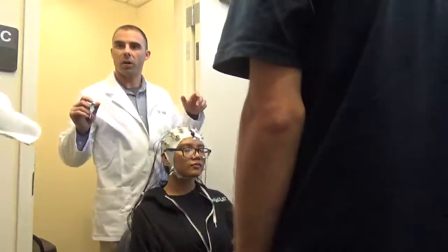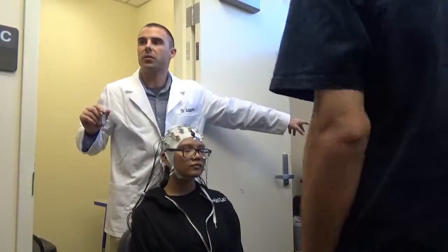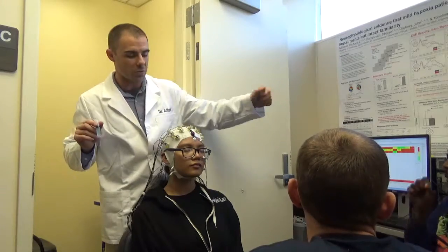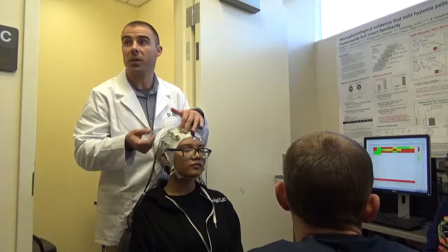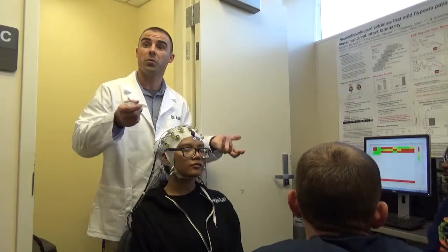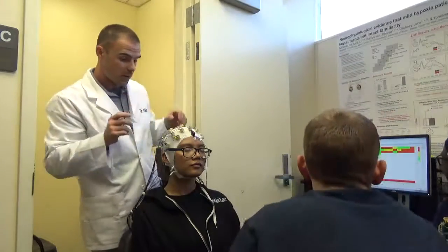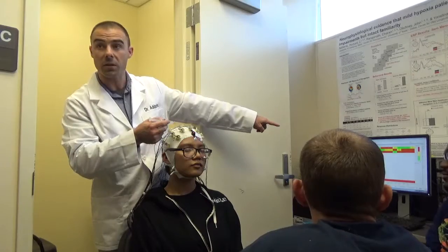let's see here. If you guys can take a look, I want you to see this computer screen, and you can see we already have those colors changing, right? Our impedances are looking different. Some are really well connected, others are not. You can imagine some of the ones that are really good are the frontal ones where there's really no hair in between. It's really just a direct connection on the scalp. And we first filled it up with gel, we let it soak in, we also worked each of them in a little bit. So we already got some of them attached. But then there are going to be some other ones that are yellow and red. You can see they're the same colors as on the sites here.